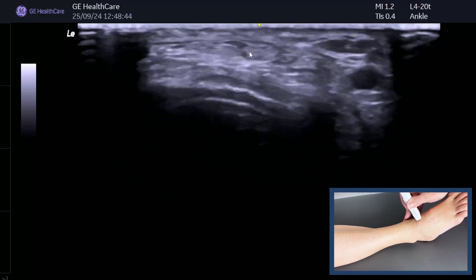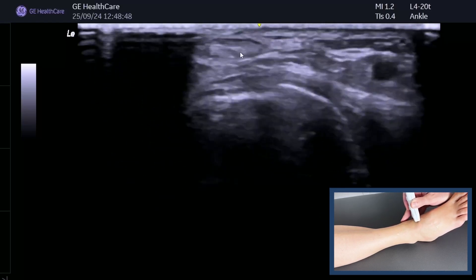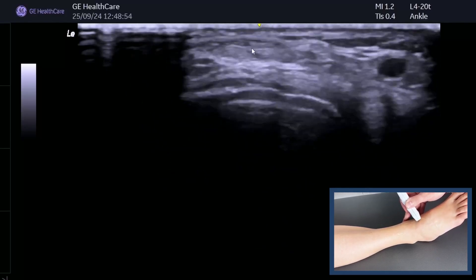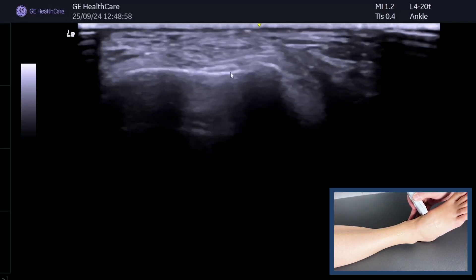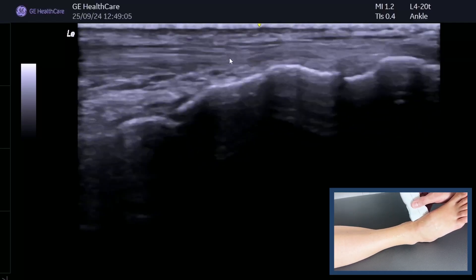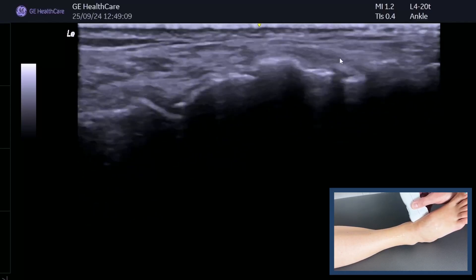The tendon goes quite medially. If you lose the tendon you can actually use anisotropy to your advantage to make it darker — you can see it there. Then we continue to follow down until it goes onto its attachment point onto the medial cuneiform. You can also spin on that and get a really nice long image as it goes onto the medial cuneiform.